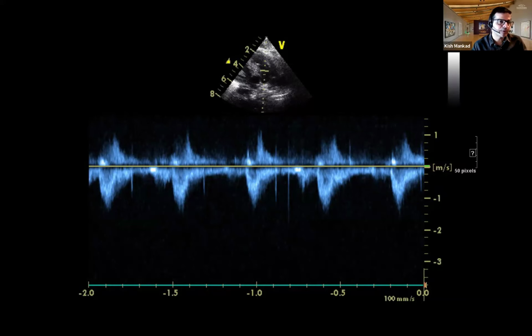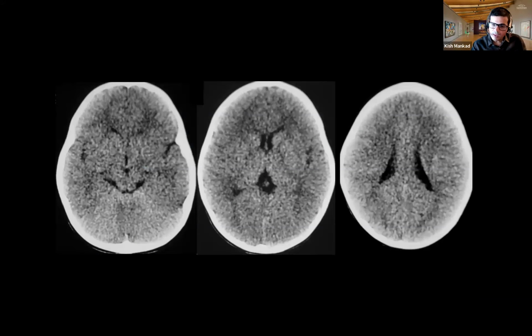In fact, nowadays, if I'm doing a CT or MR in the acute setting, I advise the clinicians to also get a cranial ultrasound done because you can press on the veins to see if they're compressing and you're not really affected by flow related changes on ultrasound. And the Doppler will also help you pick up flow when required.